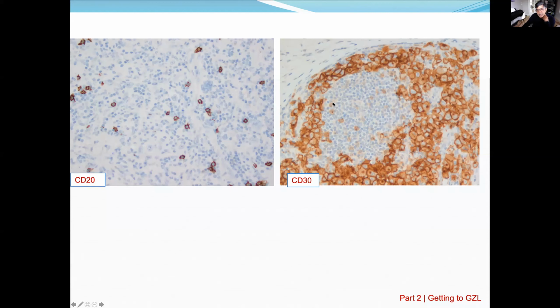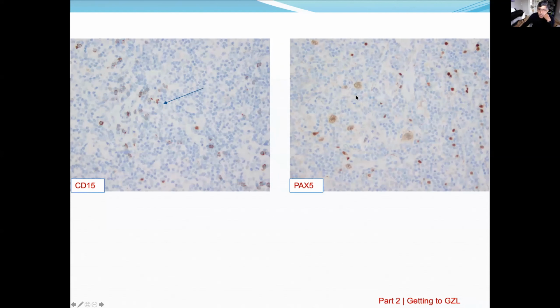And these, any area, anybody knows who these cells are? You can raise your hand at the stop maybe. If nobody answers, I'll just call on pathologists. Okay, let's see more. There's some answer coming. Chat, let's see. Yes, that's correct. These are immunoblasts. Dr. Jassim is perfect. Those are immunoblasts. Always remember, immunoblasts in Hodgkin lymphoma are always there in the background on CD30, so never confuse those.